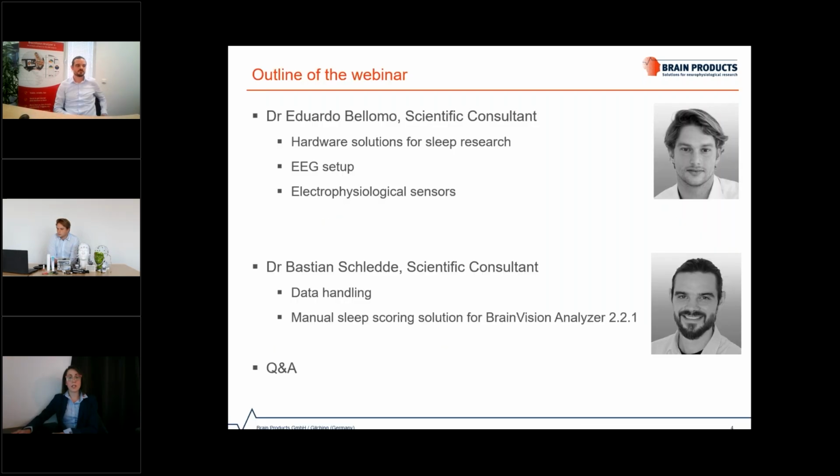One talk regarding the hardware setup for sleep studies. The second one concerns the handling of the data after you've recorded it. We'll give you a walkthrough of our manual sleep scoring solution in BrainVision Analyzer. Lastly, we'll follow up with a question and answer period.